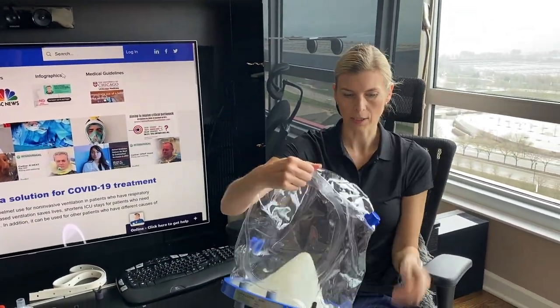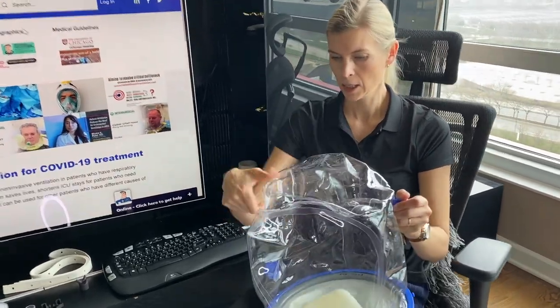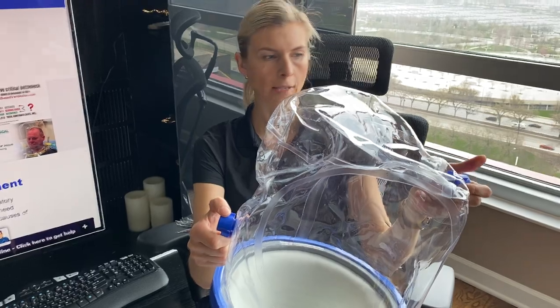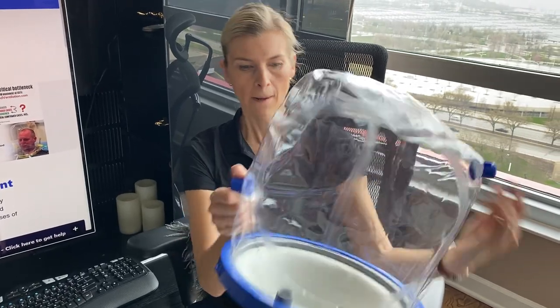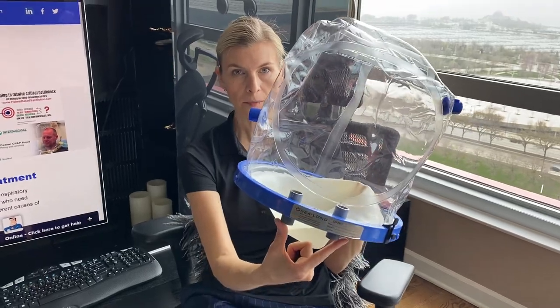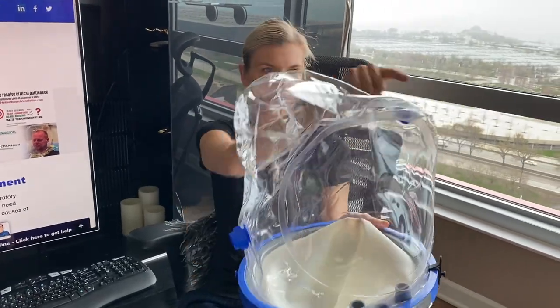In this model you can see that we added two more optional ports for your gases and for your output. You can attach them on the bottom of the ring or you can attach them on the side.